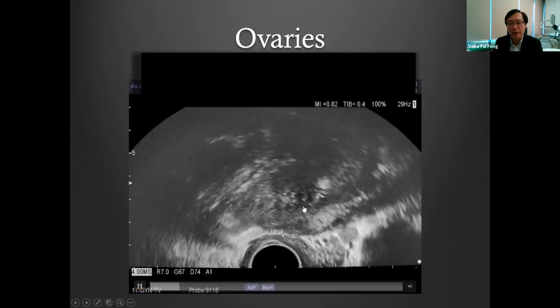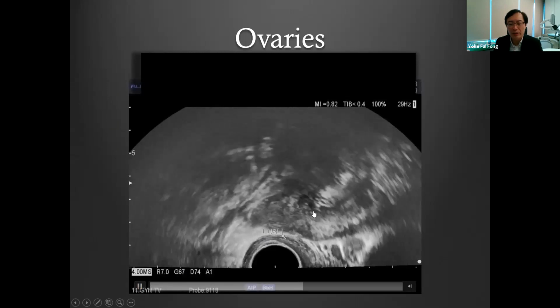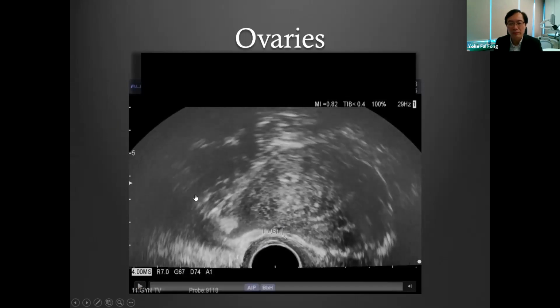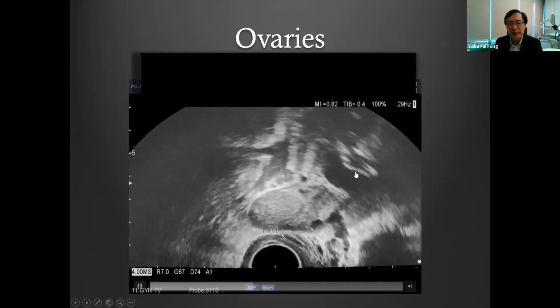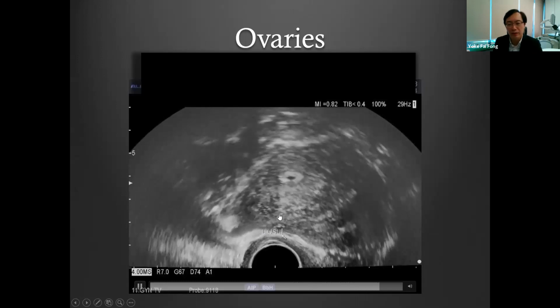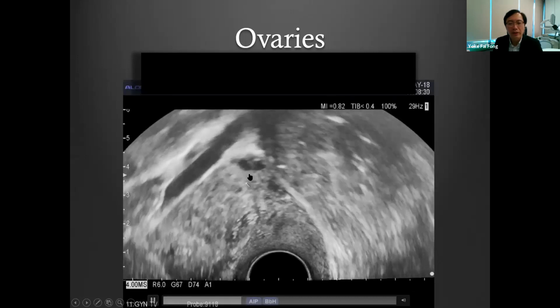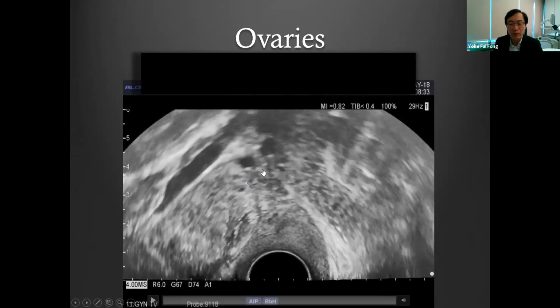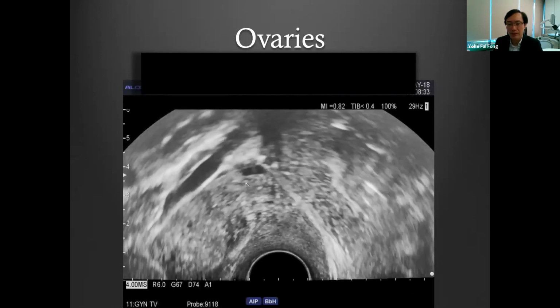So this is a picture here that shows you the left uterosacral ligament over here, and you can see the ovary just next to it. It's not so bad. It's fairly mobile. You can see the ovary over here. Let me show you again. External iliac, and then of course your ovary over here. You can see the mobility when I push, it's quite okay. This one over here, although the ovary is high, it is actually sliding. It is normal and actually is sliding. So not so bad.